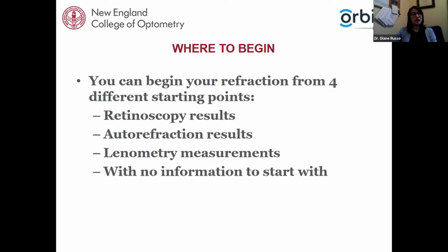They may be wearing a friend or a family member's glasses because maybe the prescription is close and it improves their vision better than not wearing any prescription, and so they wear them. But if you don't know that, and you check the lensometry and then you're working off of that prescription, you could be starting the process with inaccurate measurements. And so you should be careful if you're using lensometry and maybe ask the patient, are these your glasses?